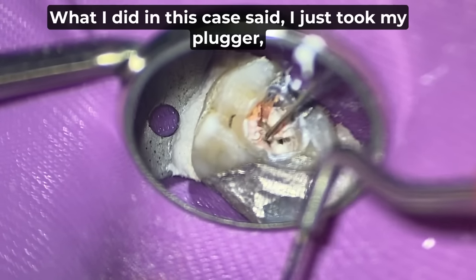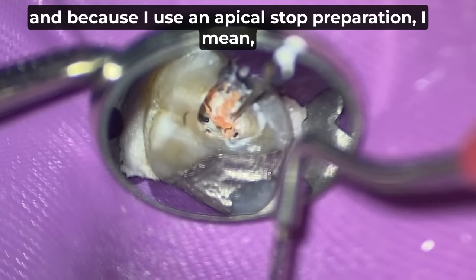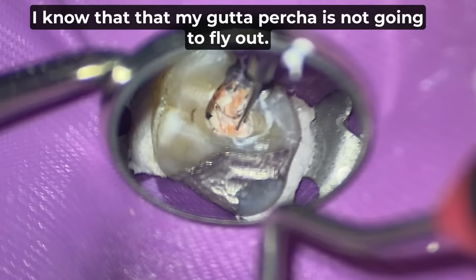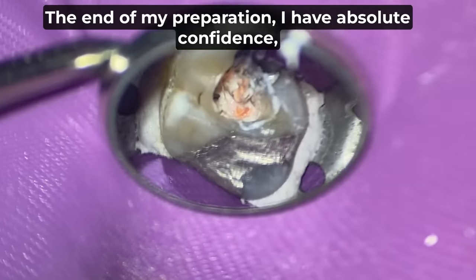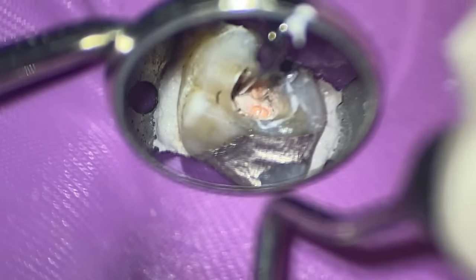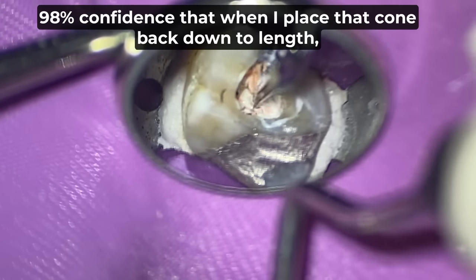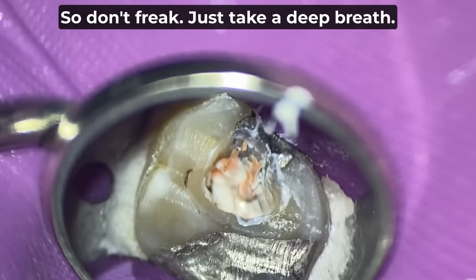What I did in this case, I just took my plugger, and because I use an apical stop preparation, I mean, you can use a continuous taper prep as well, I know that that gutta percha is not going to fly out the end of my preparation. I have absolute confidence, 98% confidence, that when I place that cone back down to length, it's going exactly where I wanted it, and it's not going too far. So that's the first tip. Don't freak, just take a deep breath.